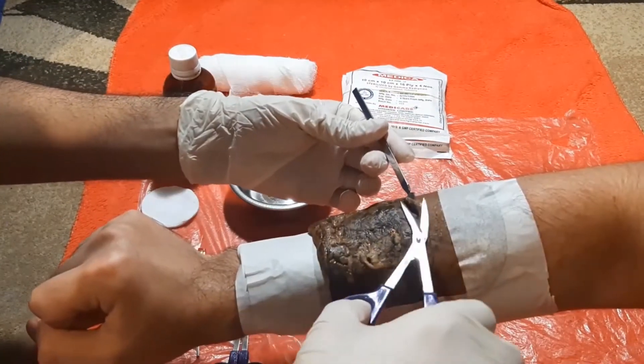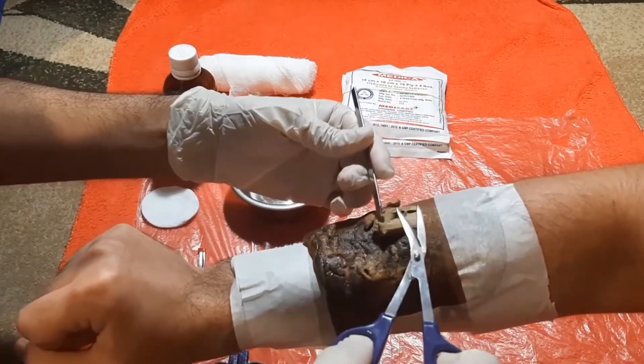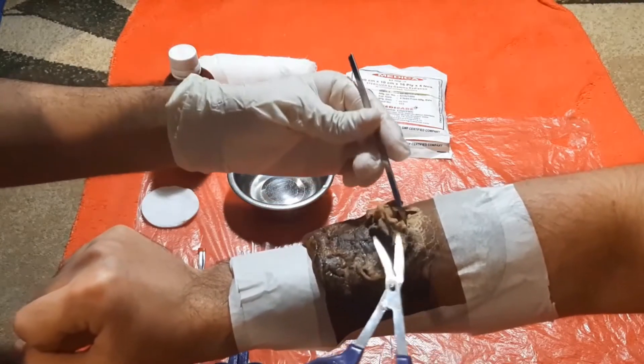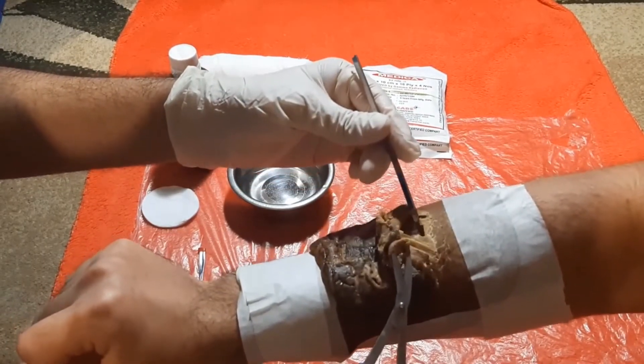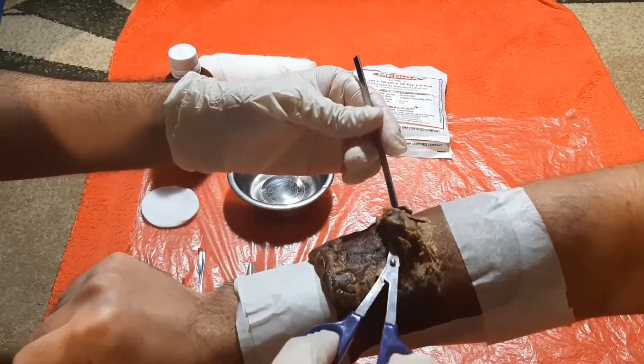Once the antiseptic solution has been applied, begin to mechanically remove the necrotic tissue from the wound. Usually a set of tweezers and scissors are used, but in this video I will be using a scalpel and scissors. Be careful to not damage any healthy tissue and also make the procedure as painless as possible for the patient.